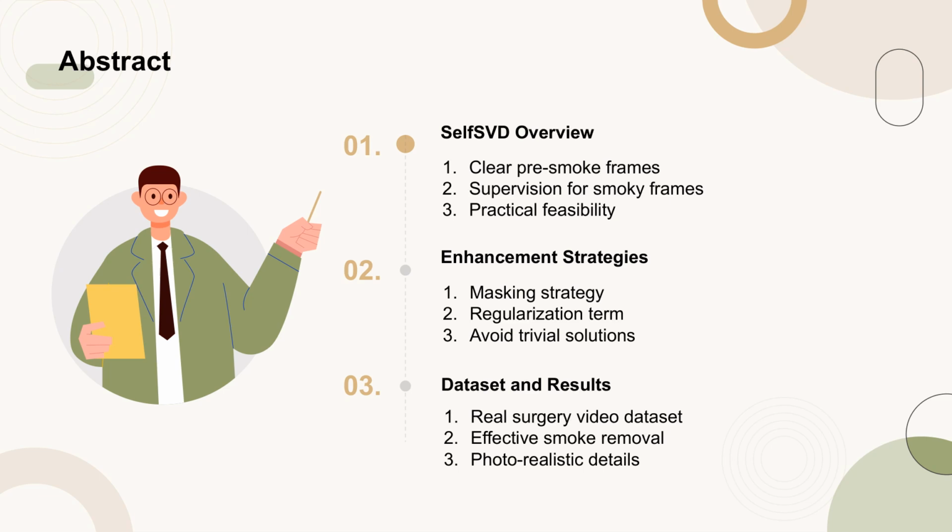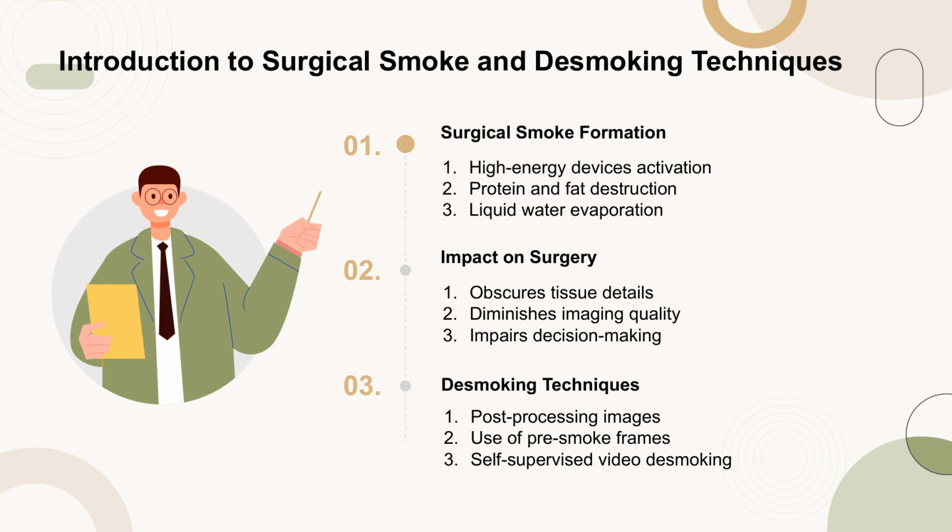To enhance desmoking performance, a masking strategy and a regularization term are introduced to prevent trivial solutions. Additionally, a real surgery video dataset has been constructed, which includes various smoky scenes. Experimental results demonstrate that SelfSVD can more effectively and efficiently remove smoke while recovering more photorealistic details compared to state-of-the-art methods.